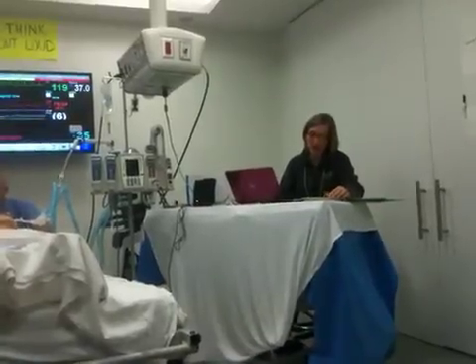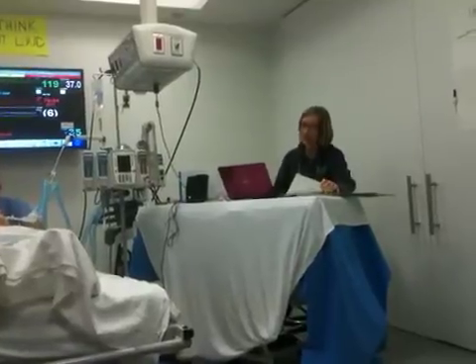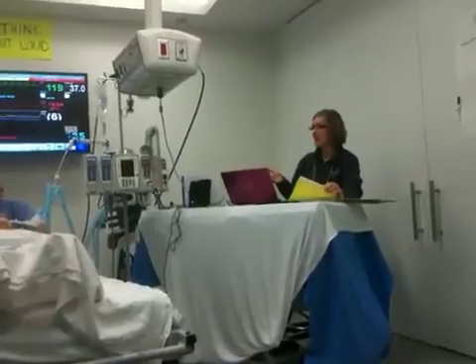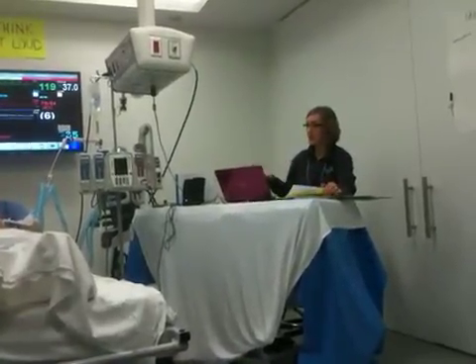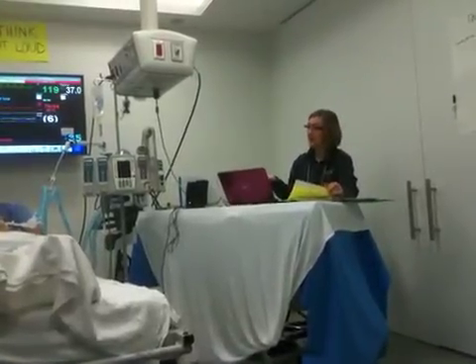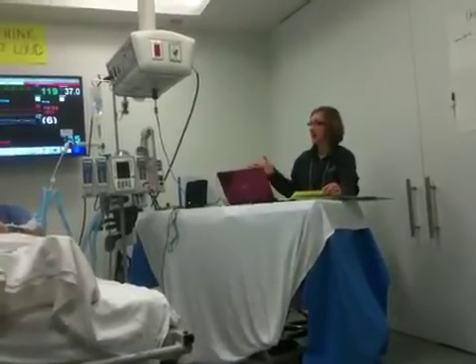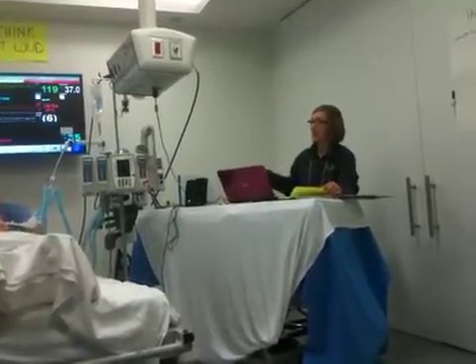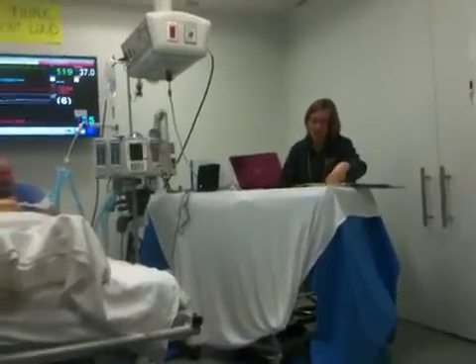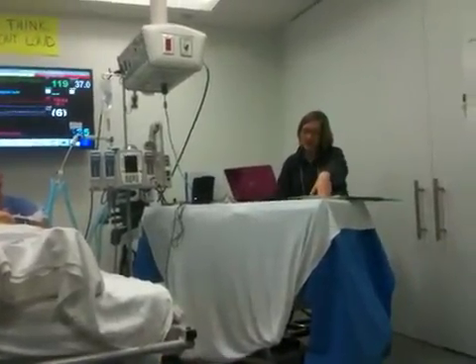With the arterial air sample, it says recognize that there's air in the circuit, check the arterial side of the circuit, but again, you're probably not going to entrain air on the arterial side because it's positive pressure, so you'd actually be spurting blood from the site that's broken on the arterial side. But in those scenarios, it would be as if air got past the oxygenator that was venous, and it's now coming out the arterial side. So that's what they were simulating in the other rooms. Check the cannulas, check the stopcocks, check medications infusing into the central catheter circuit.